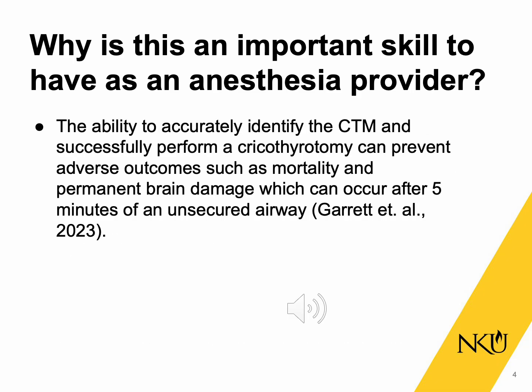So in summary, it is crucial for CRNAs to be able to manage the airway in both routine cases and emergency situations, such as a can't ventilate, can't intubate scenario. Proper training and education for CRNAs regarding cricothyrotomies could save a patient's life and prevent significant complications such as brain injury and cardiac arrest in emergency airway situations.